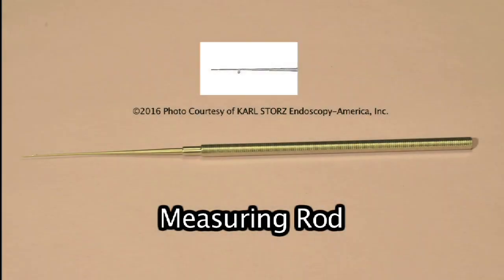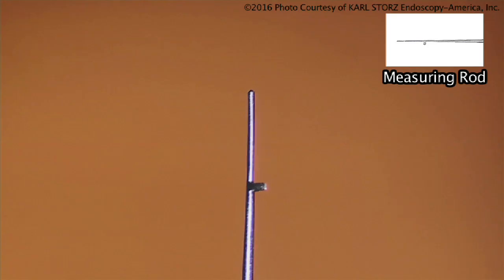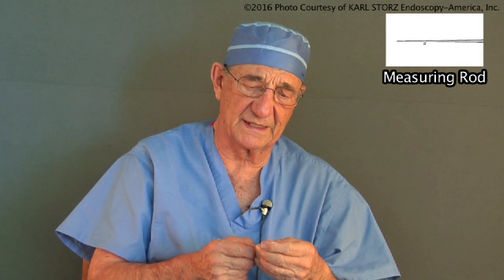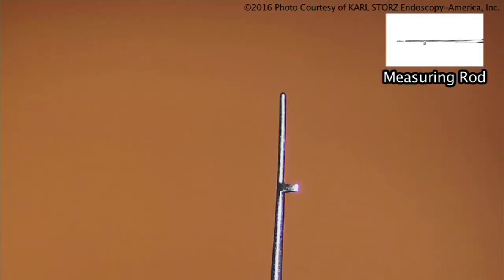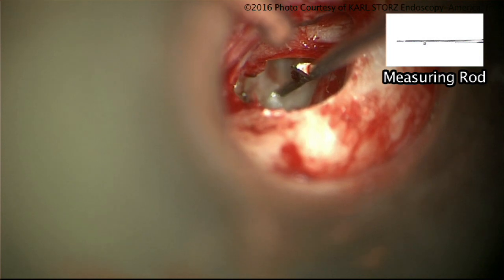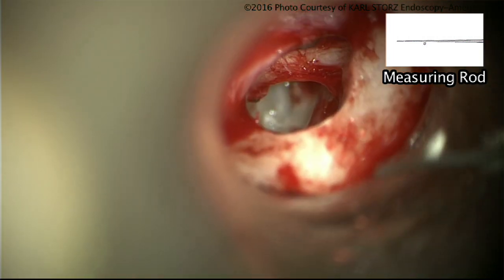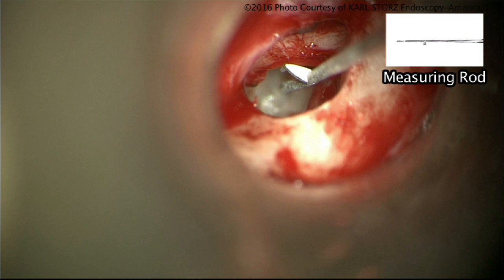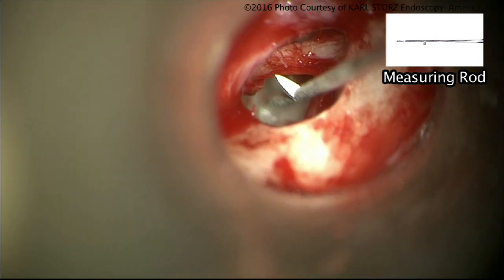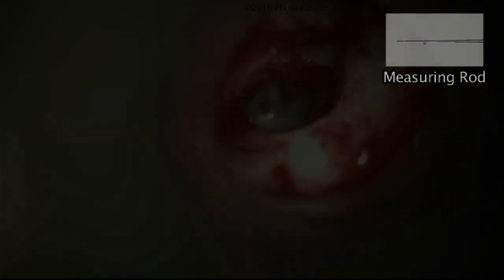This is the measuring rod, used to measure the distance for a stapes prosthesis. Some people don't use a measuring device and use a standard prosthesis, but we find that this may vary as much as a millimeter — from 3.5 to 4.5 millimeters. There's a small notch that goes on top of the incus, which then goes down to the footplate to measure the distance.